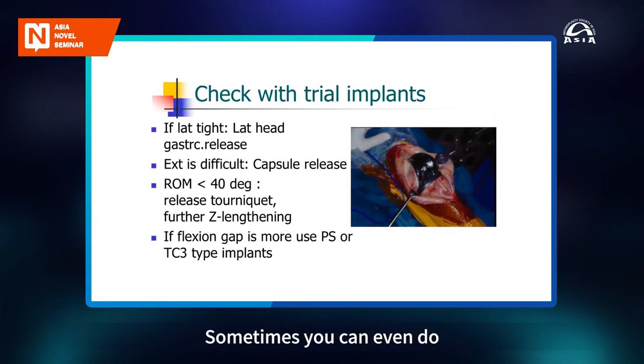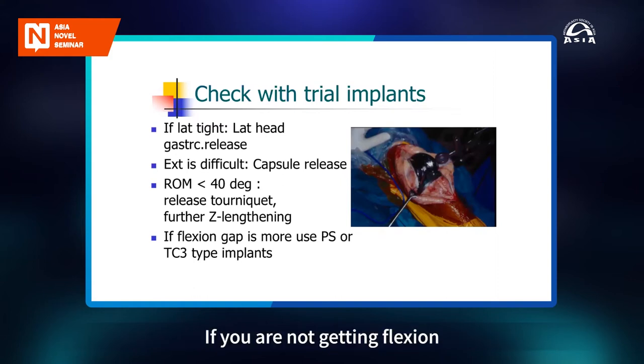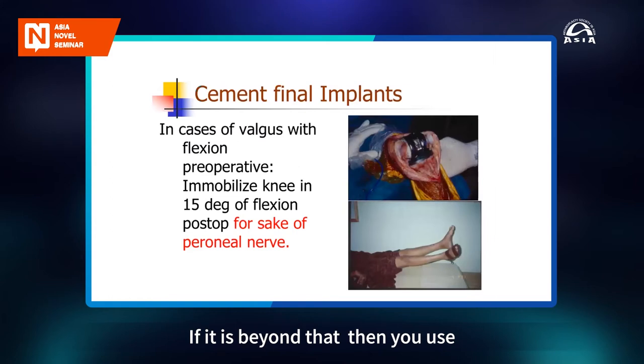Sometimes you can even do a lateral femoral epicondyle osteotomy and let it fall down, as Professor Briard from France has been talking about. If extension is difficult, you can go back and cut the posterior capsule. If you're not getting flexion, you go and do some more pie crusting or Z lengthening in the rectus femoris. If the flexion gap is more than that, but still less than 6 to 8 millimeters, you can use a cruciate sacrificing knee. If it is beyond that, then you use a varus valgus constrained knee.